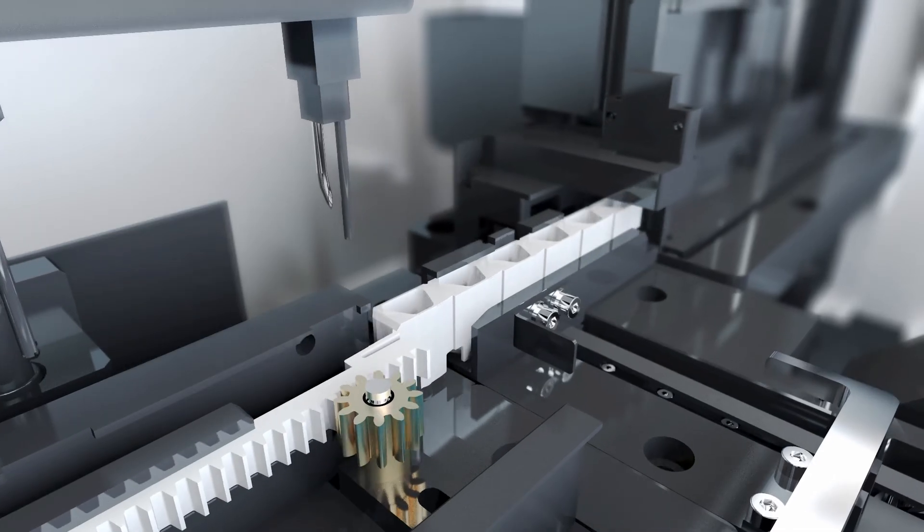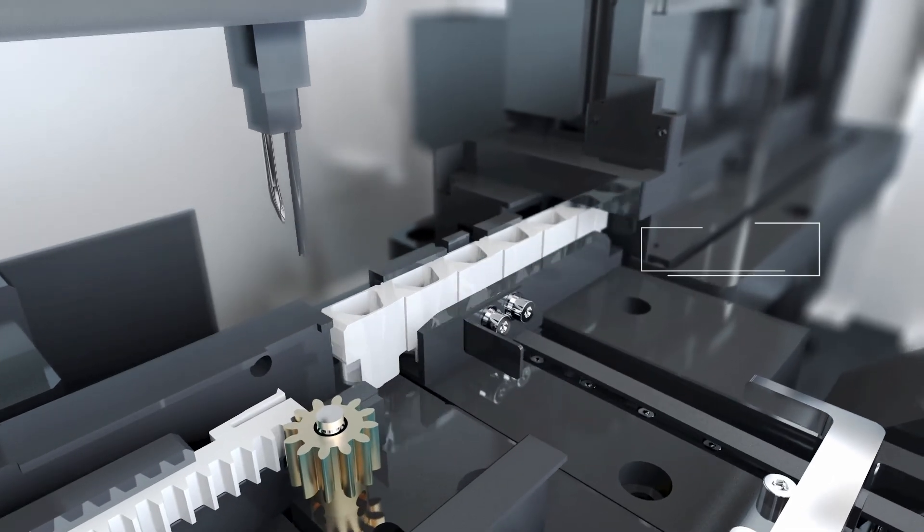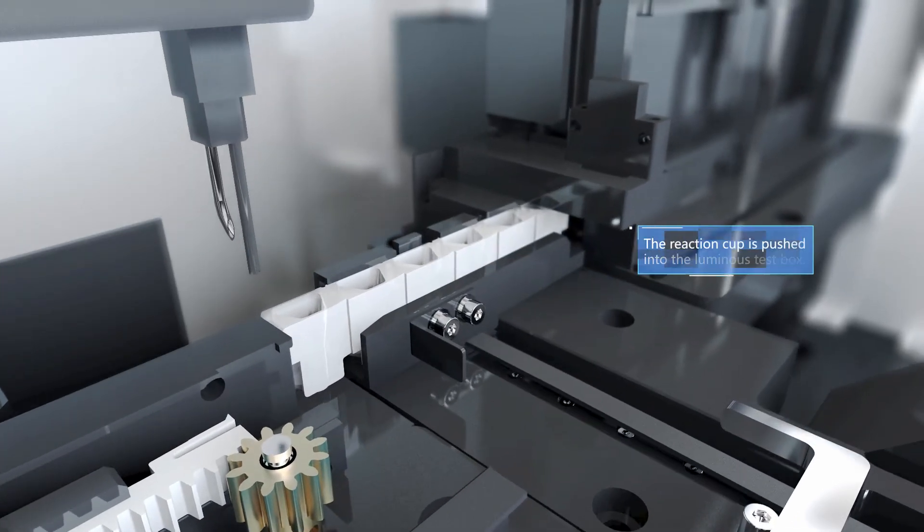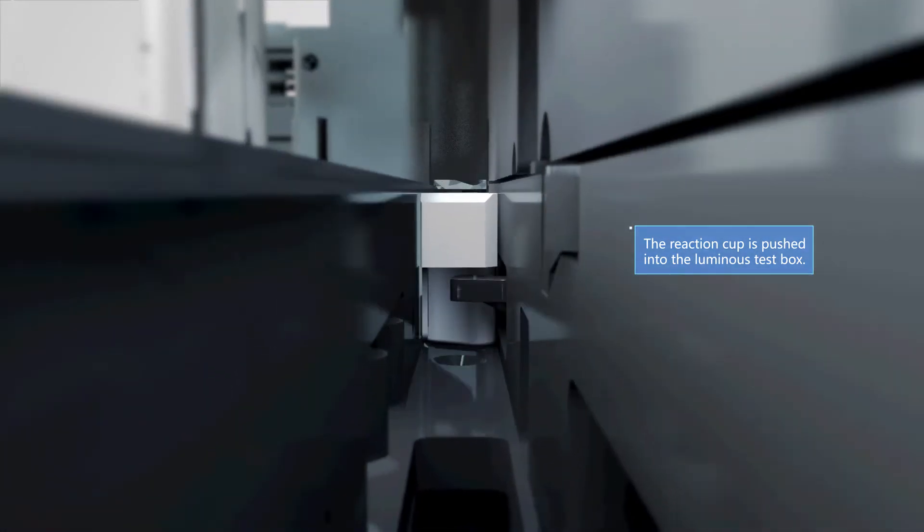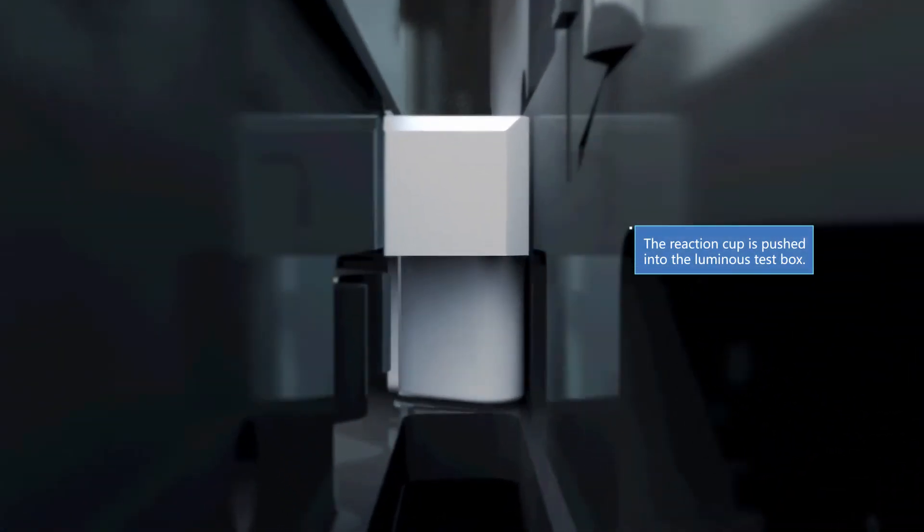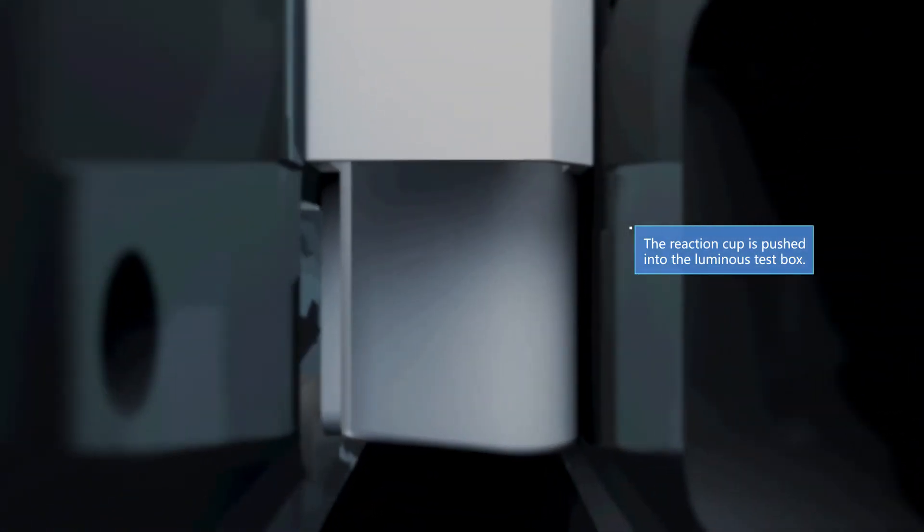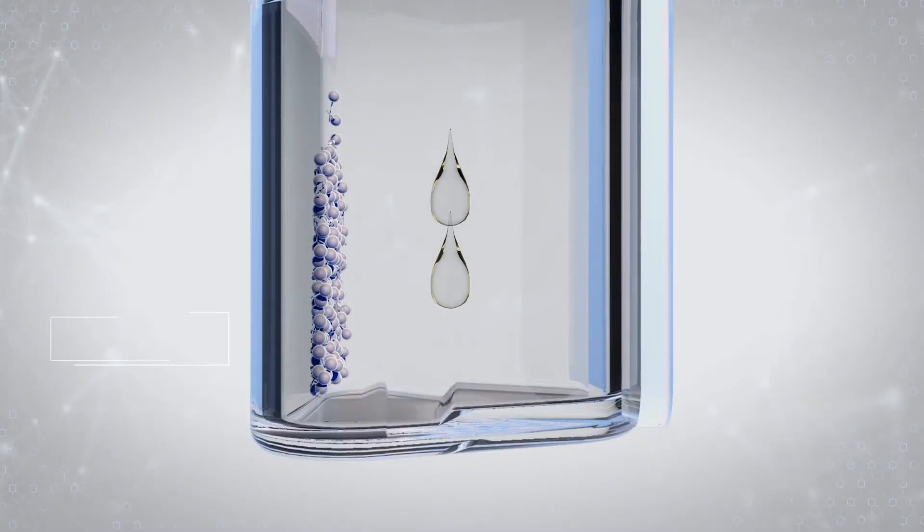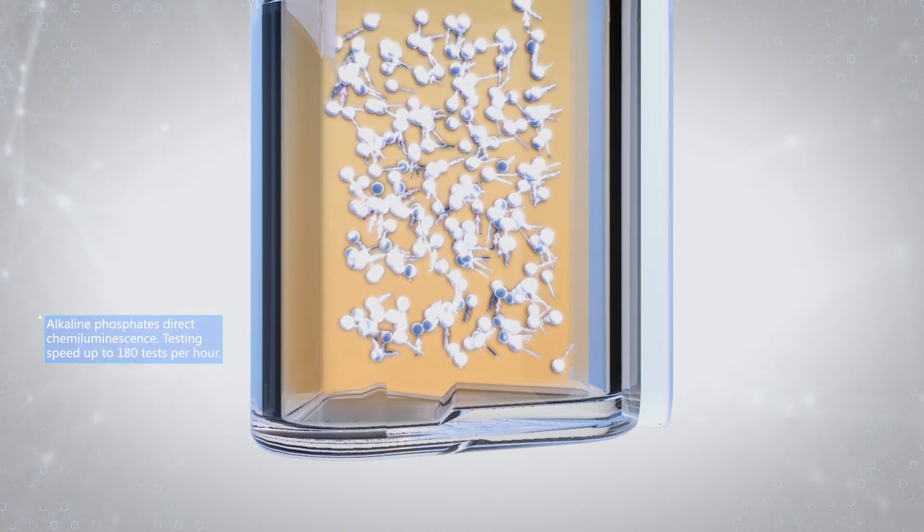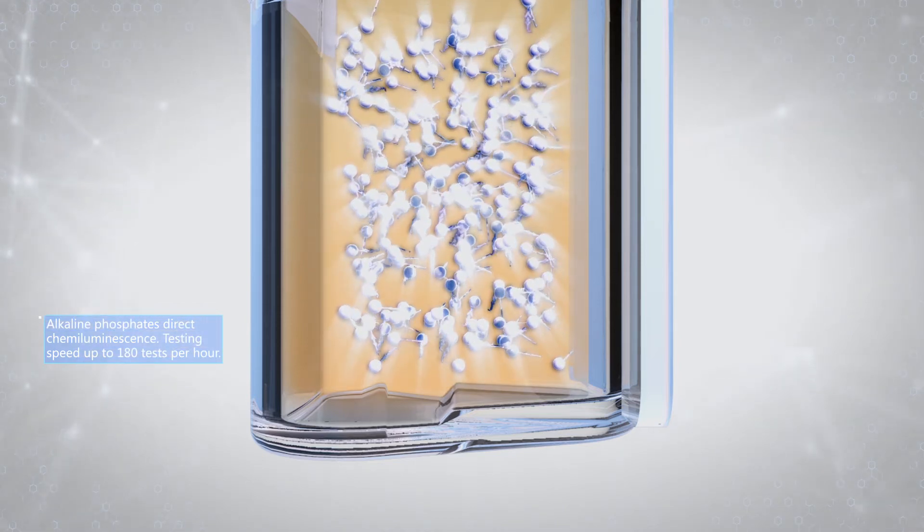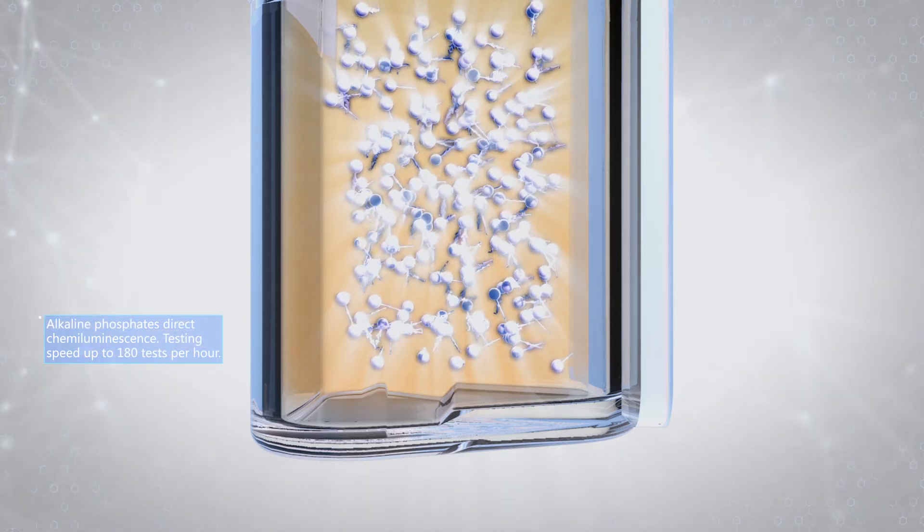Alkaline phosphatase direct chemiluminescence with high stability and sensitivity. No need for catalyst or enhancer. Testing speed up to 180 tests per hour.